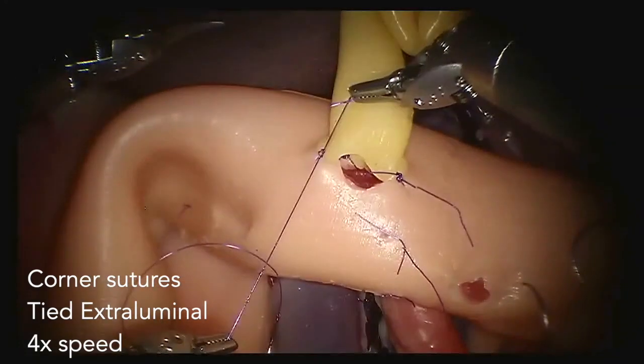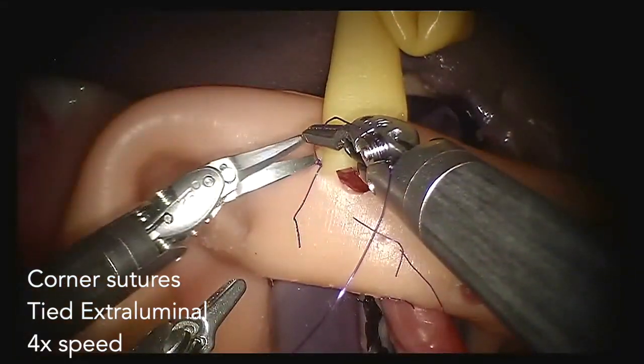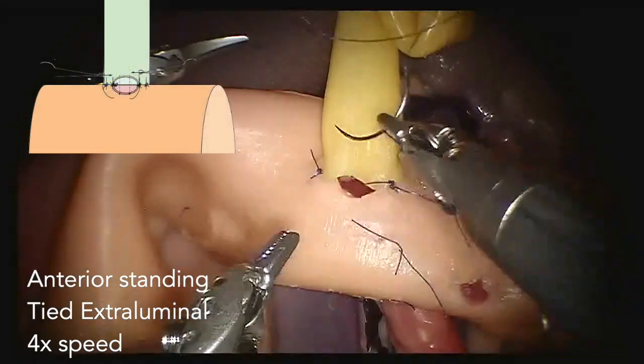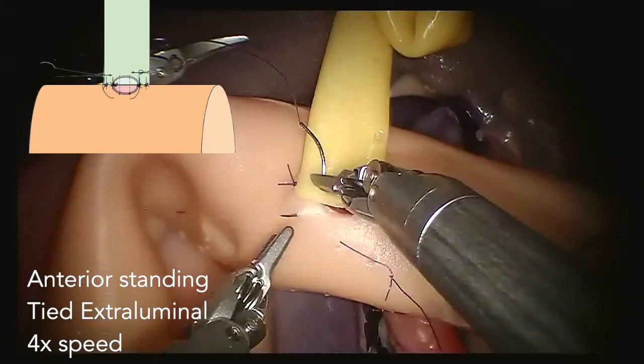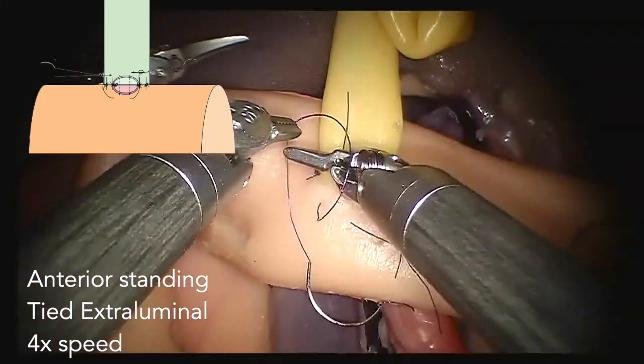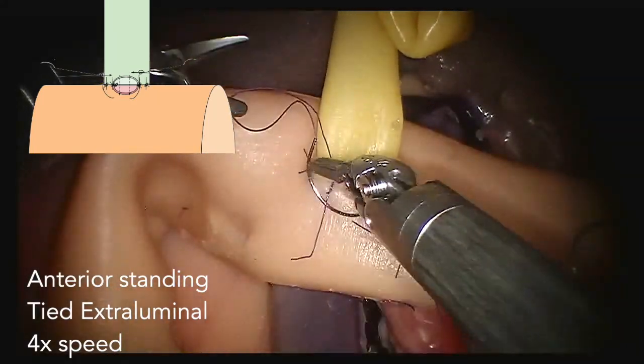For the last part of the anastomosis, we move to the anterior standing sutures. For the anterior wall it is essential to limit traction on the anastomosis. This can also be prevented by readjusting the liver retractor. Remember, the robot has no haptic feedback.